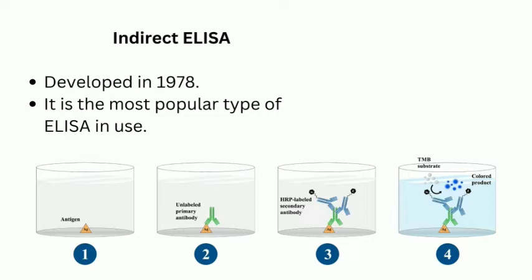This is termed the primary antibody. Then it is followed by a washing step. A secondary antibody linked with the enzyme is furnished now, followed again by washing and exposure to the chromogenic substrate till the desired color appears as a result of the product formation.